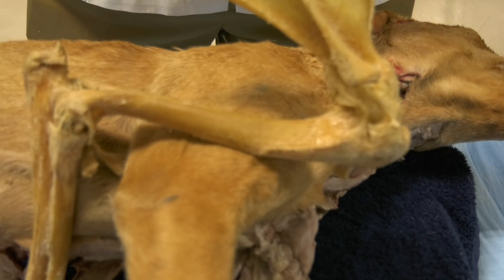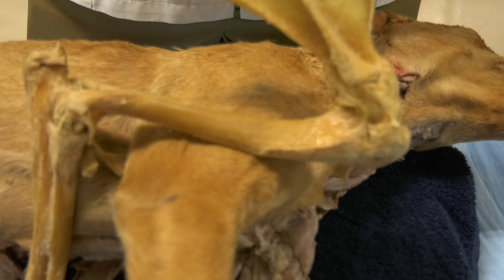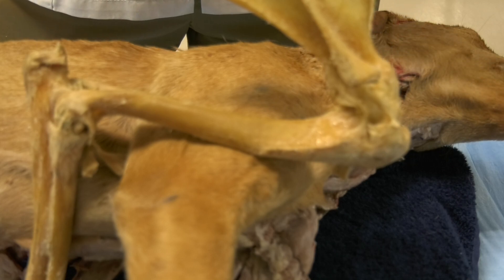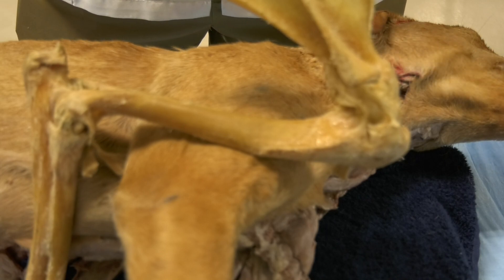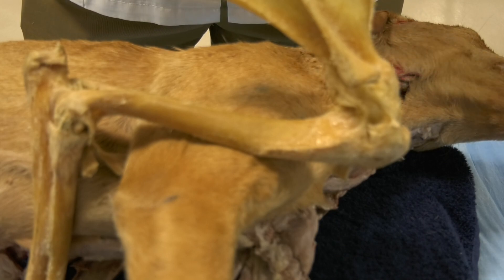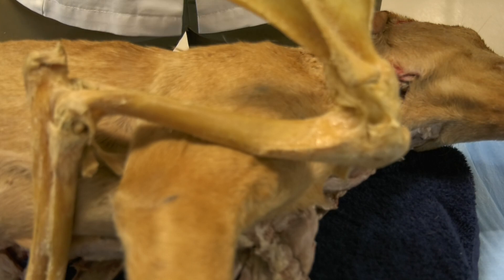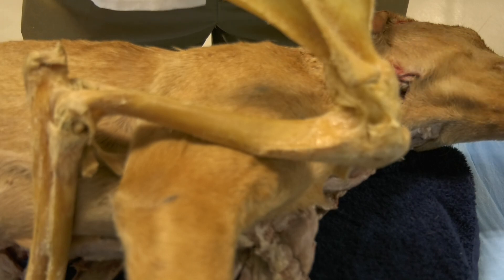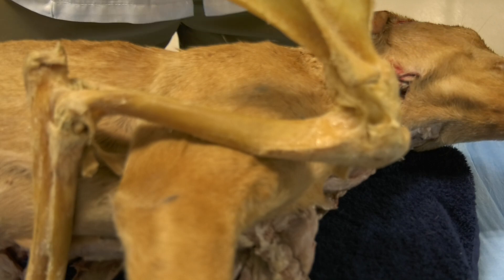It is very important that you familiarize yourself with the landmarks that you're going to use to puncture the joint capsule to give you access to the joint cavity. These landmarks are palpable structures that you can easily palpate to direct your needle in the right direction, so you can access the joint cavity successfully and with minimal trauma to the tissues.